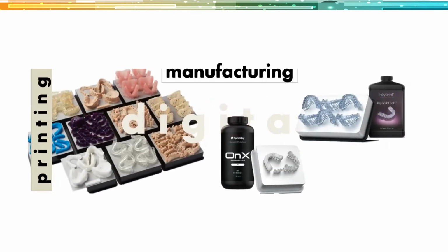And the reason that we are printing so much more today than we were when I first started, my first printer I got in 2017, is that we have the availability of so many FDA cleared resins that we can actually produce a lot of different things that are biocompatible. And so these are some of the things that we print, and some of the products that we use.